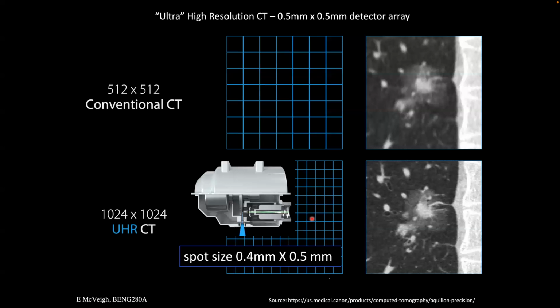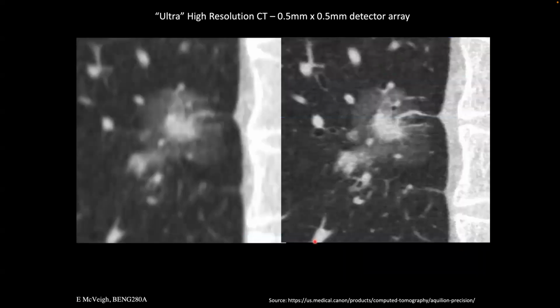And so that's a big ask to make an x-ray tube like that, but they did. And this scanner, I think, works terrifically well in pretty thin people, like smallish people, right? If you're a really big person, it's hard to make enough x-rays with that tube to get through.